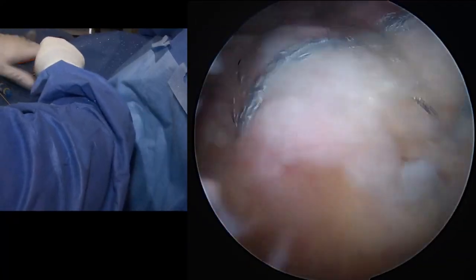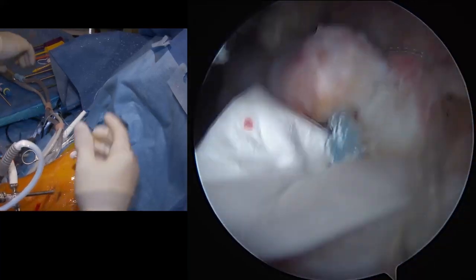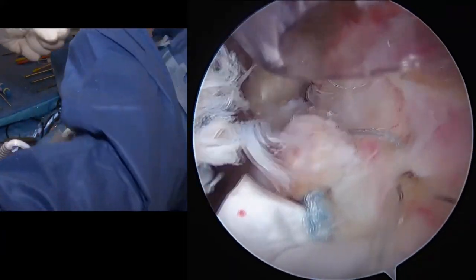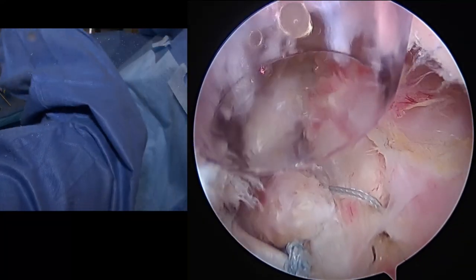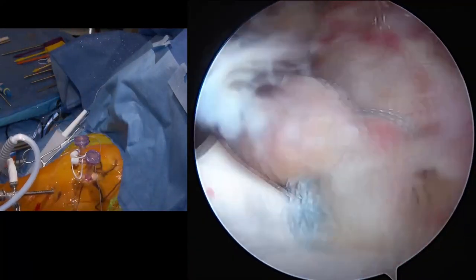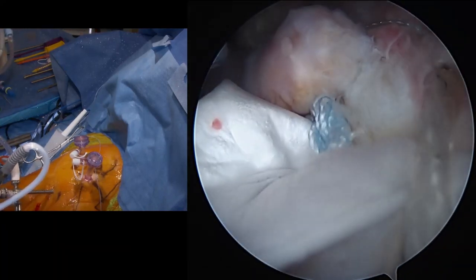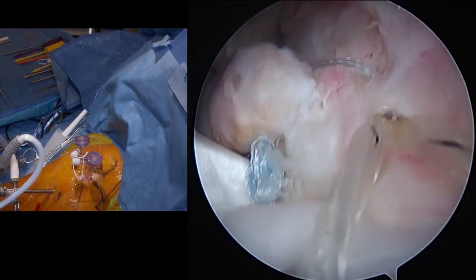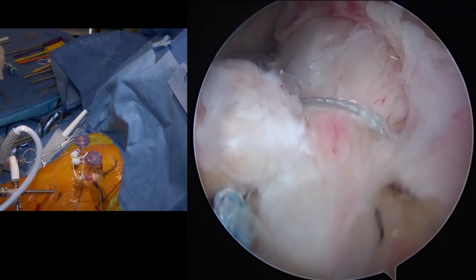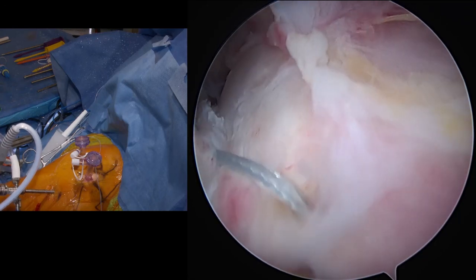Okay, good. All right, let's have our shaver. My fault. I can use the other one. Just give me the smaller one for now. It's okay. He just dropped it. Go this way, which is the way we always do it. Whenever we get out of routine, something happens, right?